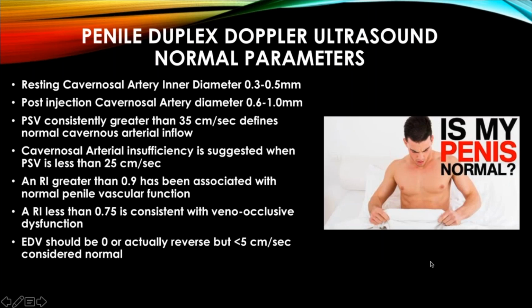Most important thing is what's normal. Every guy has that question, is my penis normal? And the resting cavernosal artery diameters are very small, 0.3 to 0.5 millimeters, much smaller than coronary arteries. Post-injection, they about double in size to 0.6 to 1.0 centimeters. I'm sorry, millimeters.